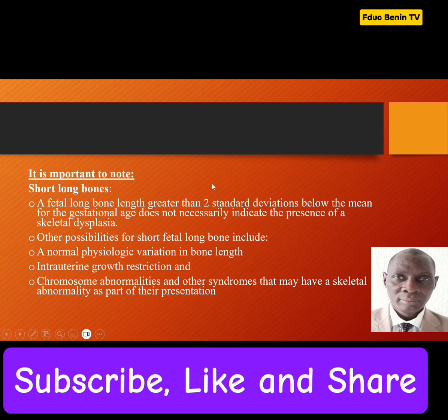It is important to note the following: short, long bones.